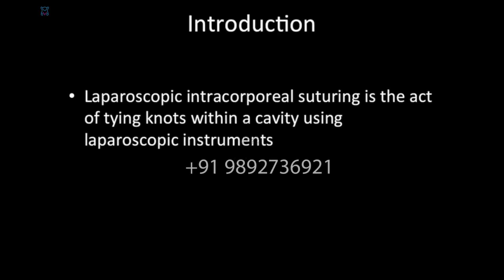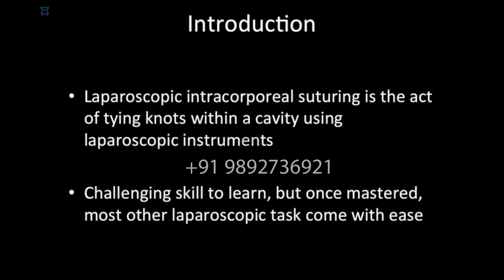Laparoscopic intracorporeal suturing is the act of tying knots within a cavity using laparoscopic instruments. This is a challenging skill to learn, but once mastered, most other laparoscopic tasks will come with ease.